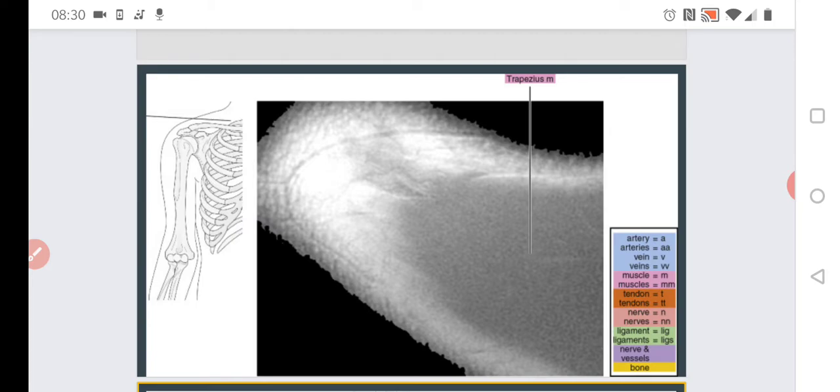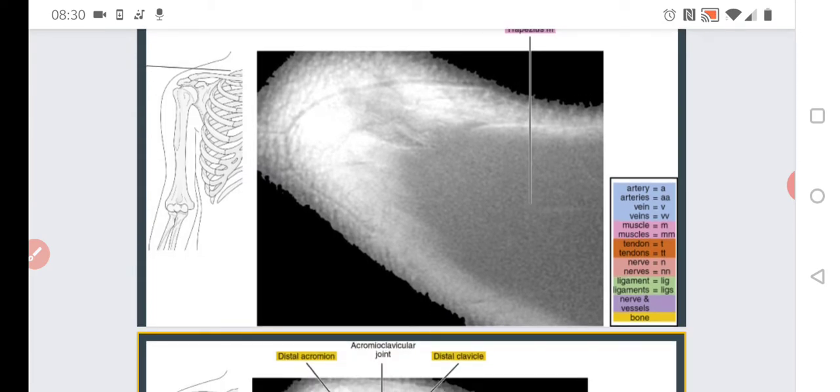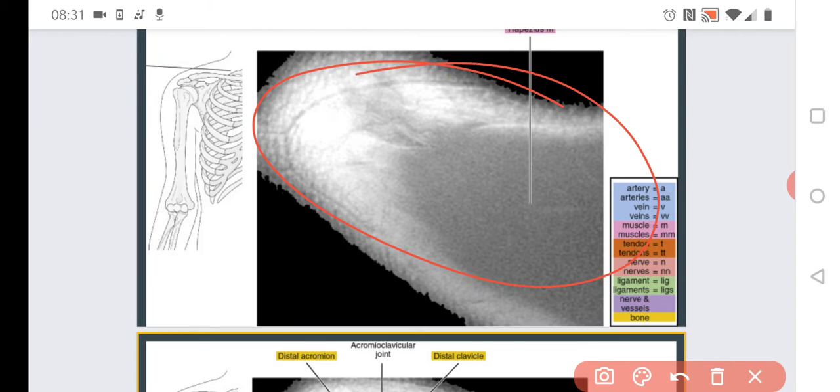So we'll get slowly section by section through the shoulder now. Of course, what you can think about, what is in the shoulder and how to look at least in these pictures. This is how we would cut the body, let's say, digitally, in order to obtain this view. Yes, so we are here. We are just above the clavicle, as you can see.